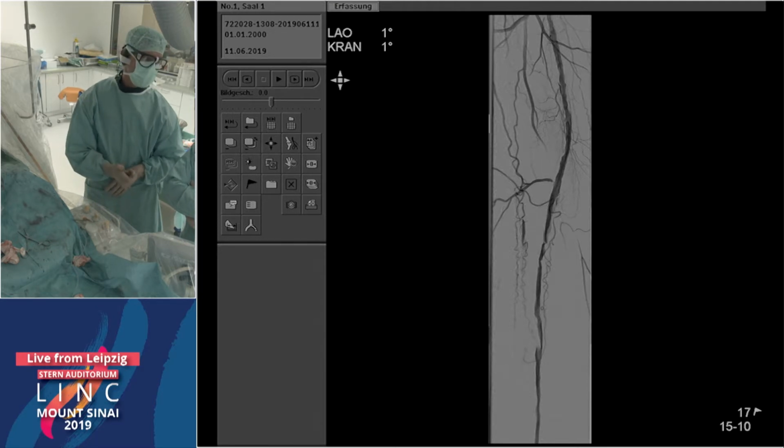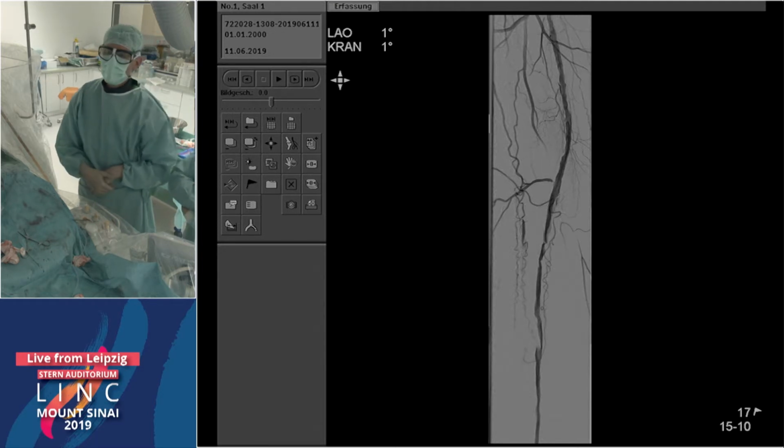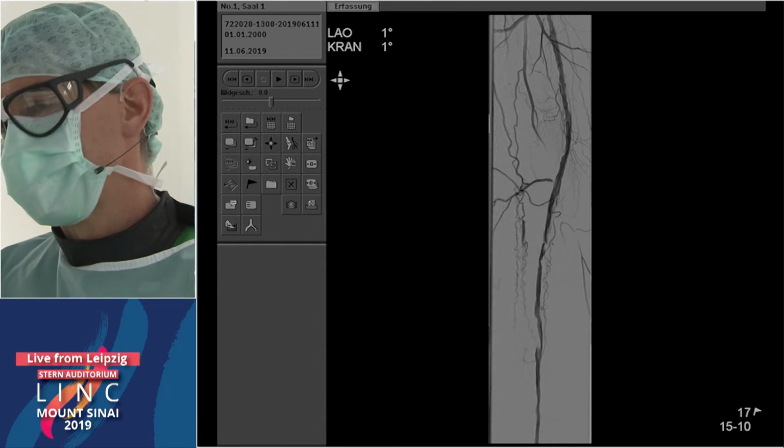Shall we take a 5? Kurz? Hatte keinen Schmerz, können wir schon machen, ne? Okay, yeah. What do you think?